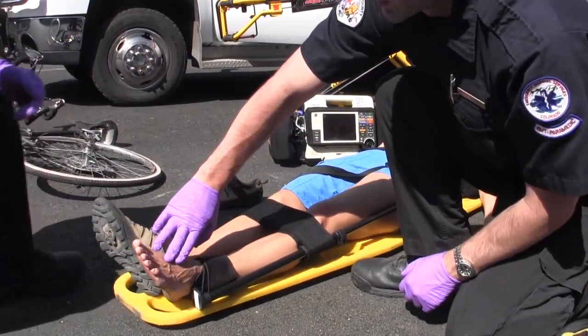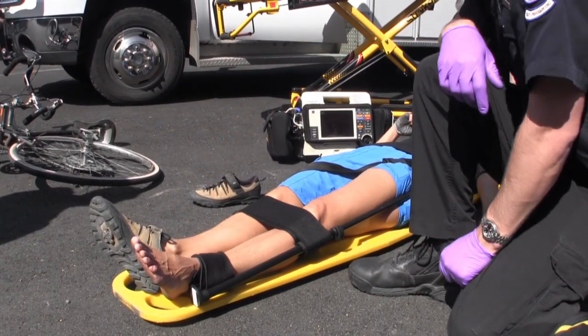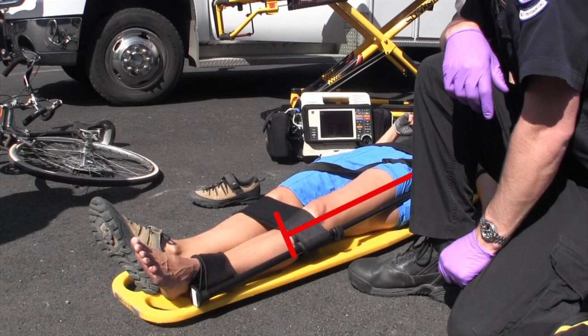The patient is now packaged for transport. Note that in the event of a concurrent ankle injury or even a foot amputation, the ankle strap can be applied proximal to the calf, and femoral traction can still be accomplished.